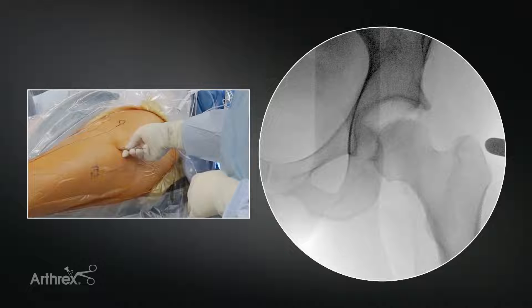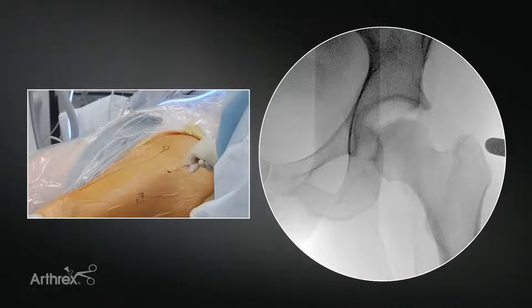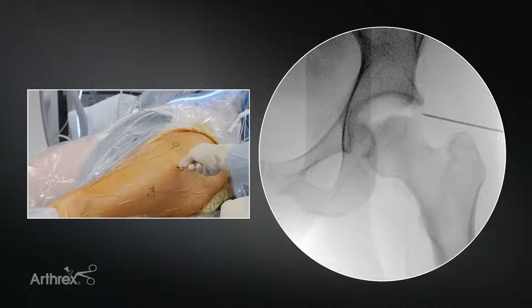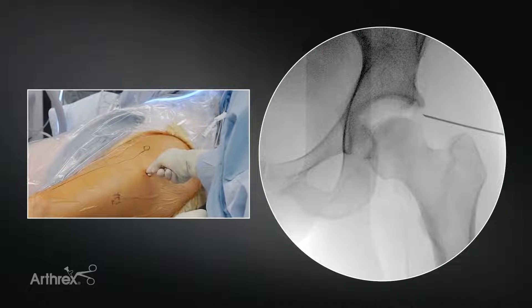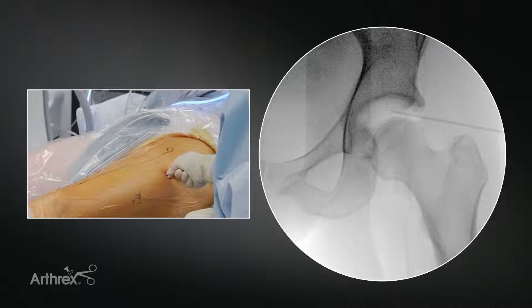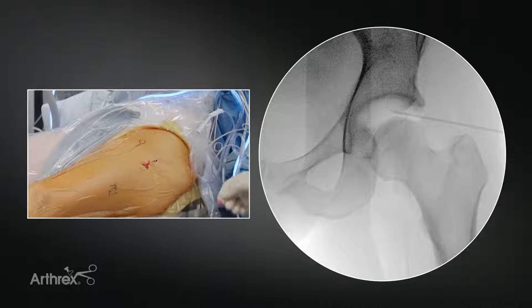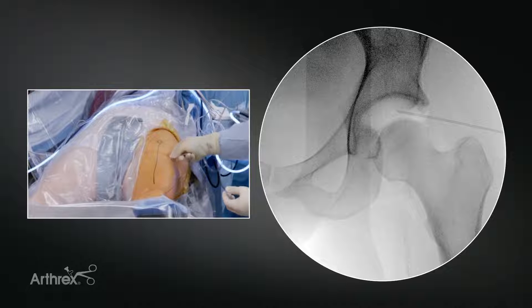I like to make my portals based on topical landmarks that I can feel as well as using fluoroscopy. We've got access to the joint. One of the nice features here is that we can titrate our traction. At this point she has an appropriate space for accessing the joint, but if we needed to, we can vent the joint, which will give us an air arthrogram so we know we're in the joint. We can then apply some fine traction if we need more. Another benefit is we can get a great assessment of the stability of the hip joint based on how easily it comes into traction without a post. I think it gives a truer sense of stability when we don't have paralytic on board and we don't have a post.